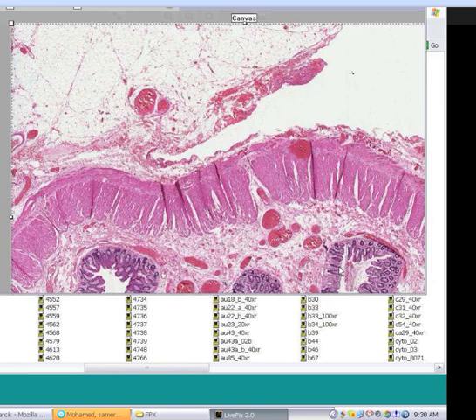And right now, I want to tell you the algorithm for all gastrointestinal organs. In an orderly fashion, you have to look at the mucosa and ask yourself, is it squamous or is it glandular? Well, if it's squamous, it's esophagus, isn't it? If it's glandular, it's either small bowel, large bowel, or stomach. If it's glandular with precise villus projections, then it's small bowel, isn't it? If it's glandular with pits and crypts, then it's either stomach or large bowel.